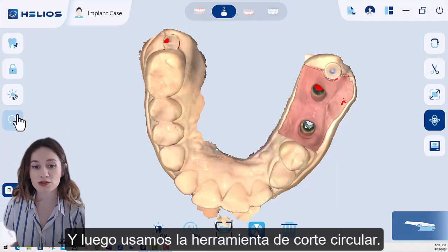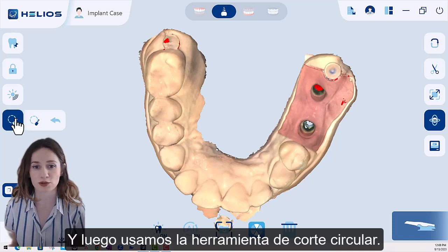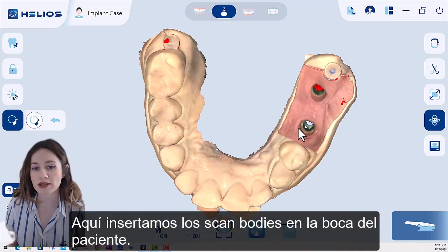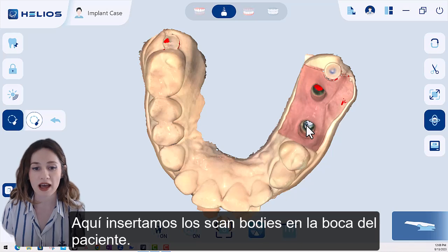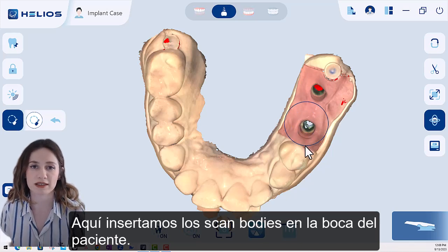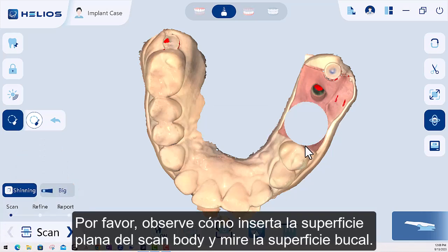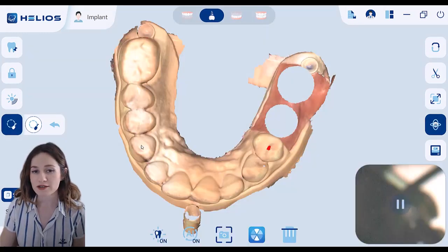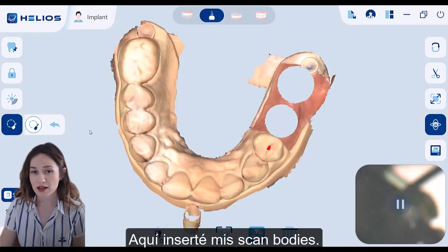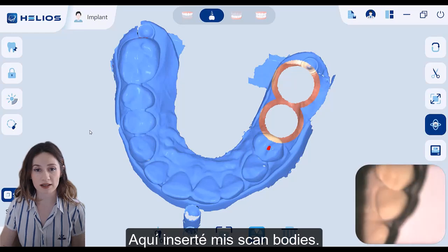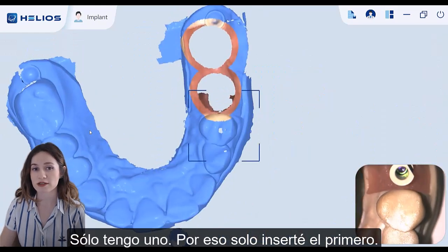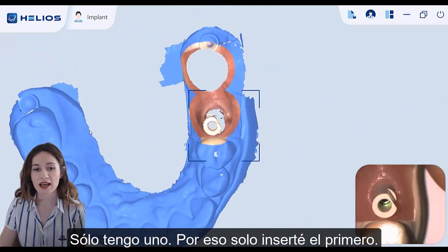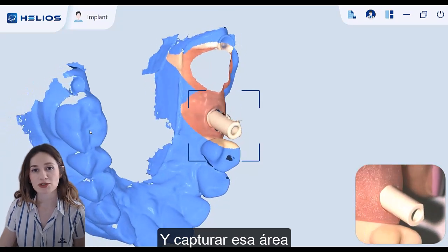Then we use the circle cut tool. The software will erase these areas and capture only the scan bodies for us. Please make a bigger circle than the gingiva shape in order to capture the scan body smoothly, like this. Here I inserted my scan bodies — I only have one, so I inserted the first one and captured that area.